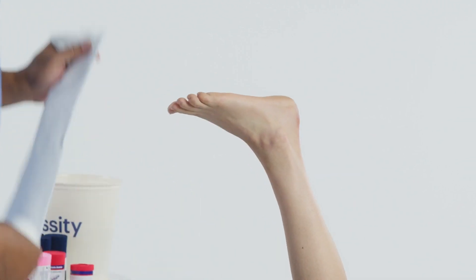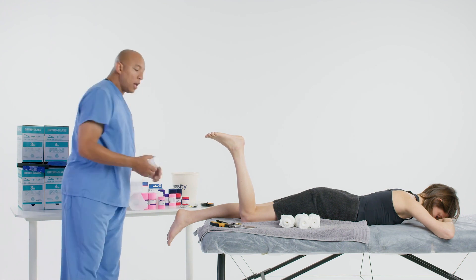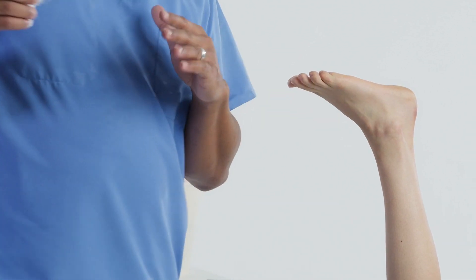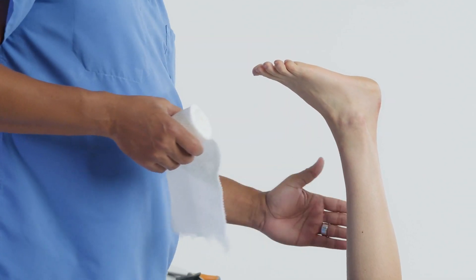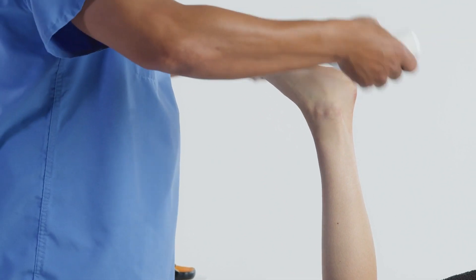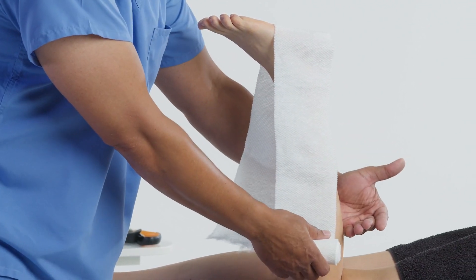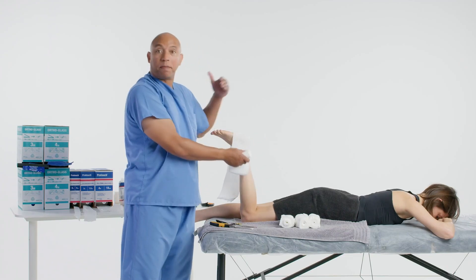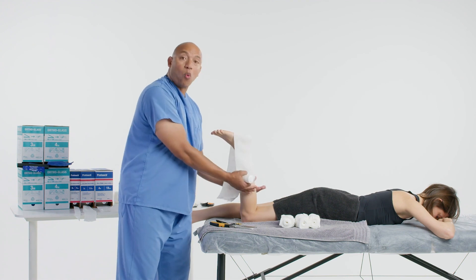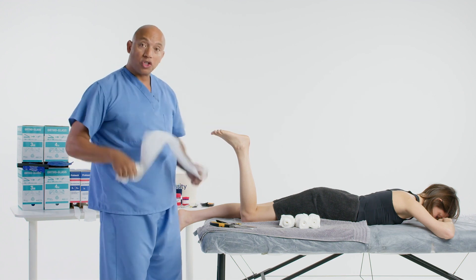We want to make sure this measurement is pretty good. We'll have this about two inches past the tips of the toes. When we get ready to apply the splint, we fold the splint to make a nice little thick bumper. Now let's do the stirrup. The stirrup is our lateral to medial stirrup, or the U. You can have it two ways depending on the patient's injury, but generally you want the stirrup to have the same termination point as the posterior slab, or at least to the widest portion of the calf.